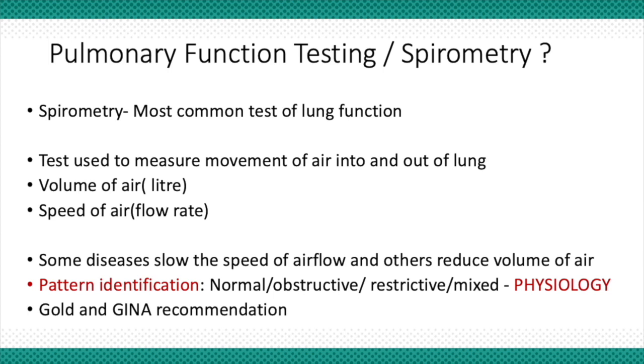While lung diseases affect the flow, or the speed of air in and out of the lungs, or the expansion of the lungs, through these maneuvers this test is basically used as a measure of the pattern of change, of the affection of various volumes, capacities and variables, to measure how the physiology inside the lung has changed.